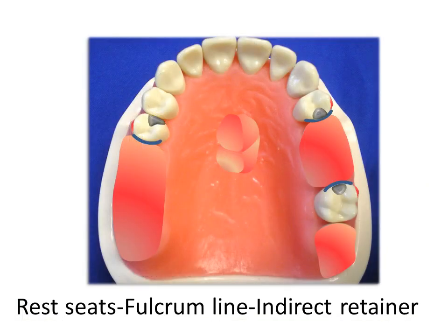The abutment teeth in this example are examined on the articulator. We prefer that areas of rest preparation are not located in areas of habitual occlusion. If possible, Marie, we locate the rest seats as indicated in the diagram. These locations are easily accessible and may be conservatively prepared.